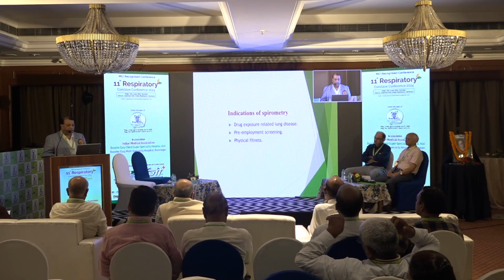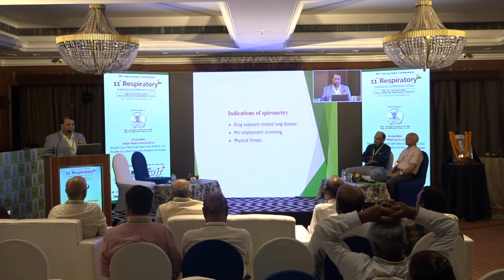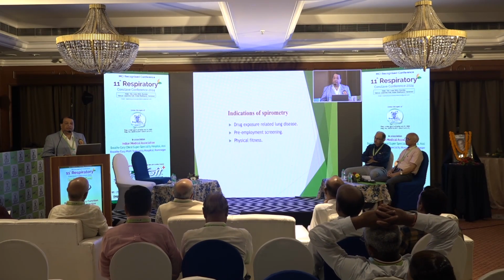It is used for surveys of pulmonary diseases and to follow up cases, to monitor the treatment of bronchial asthma, COPD and anything else, and for evaluation of impairment of the lungs, identification of high risk groups like smokers, and serial spirometry, occupational surveys, and environmental hazard detection. Other indications include drug exposure related lung diseases, pre-employment screening, which is very important for any employment, and physical fitness. We are just doing spirometry to see how well the lungs are working.